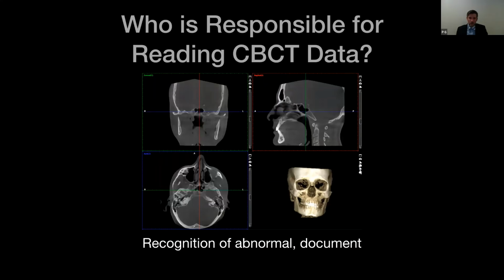So I don't want the fear of missing something from you. I don't want you to have that be a fear and not purchase a cone beam machine if you're on the fence about going 3D for your office.